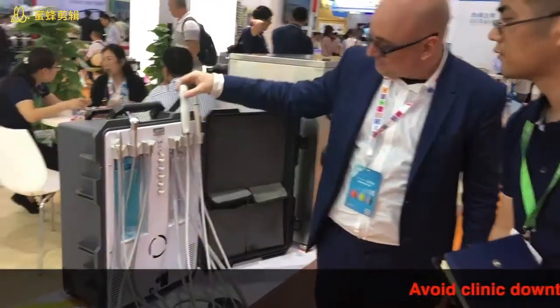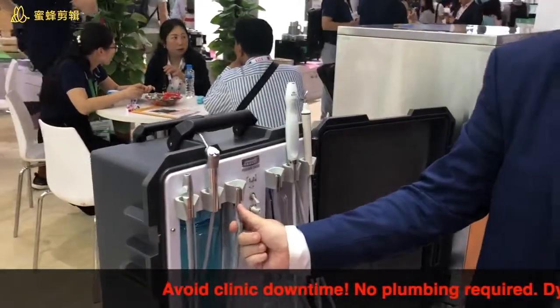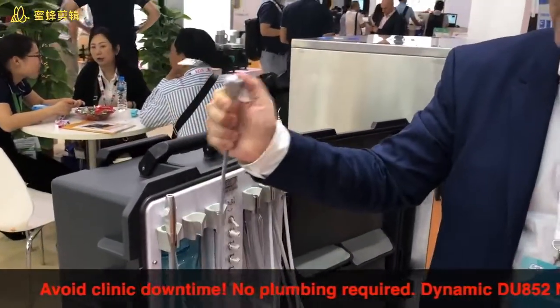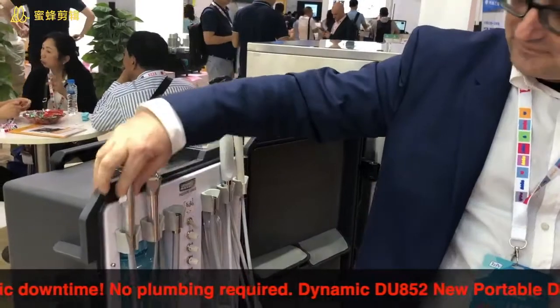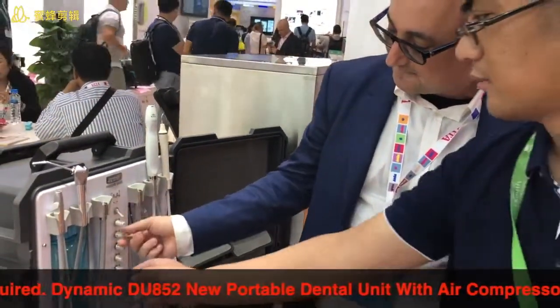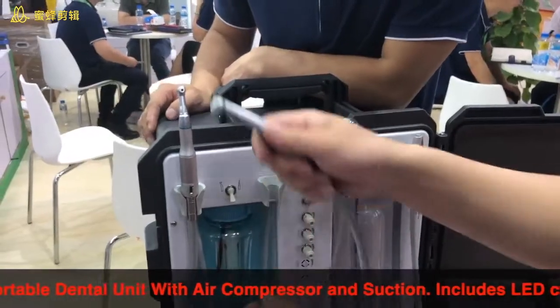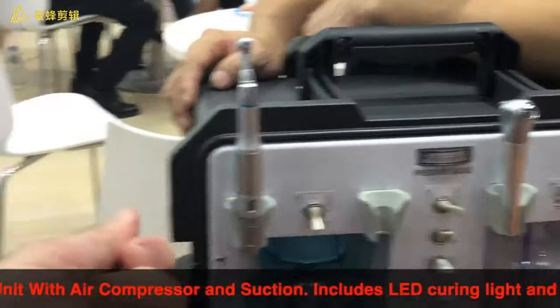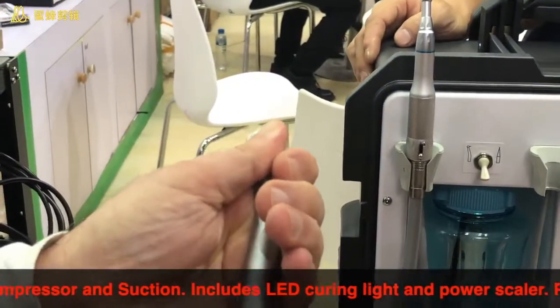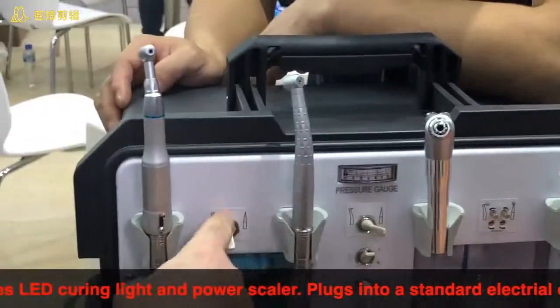Scaler, we have a curing light, we have high speed, we have low speed, we have air, water, and we have a suction. And we can control everything, adjust the air pressure, the water pressure. That's the handpiece. And then this is a 4-hole connector. So you can choose the low and the high.